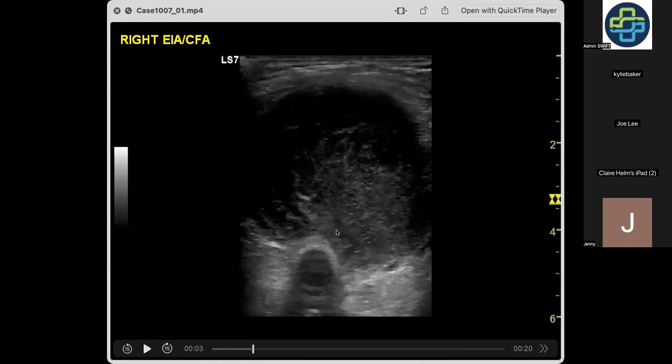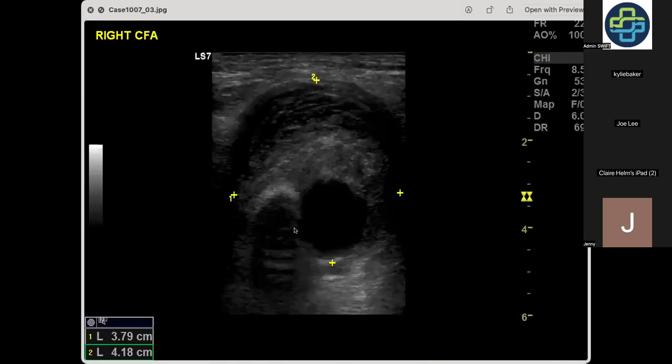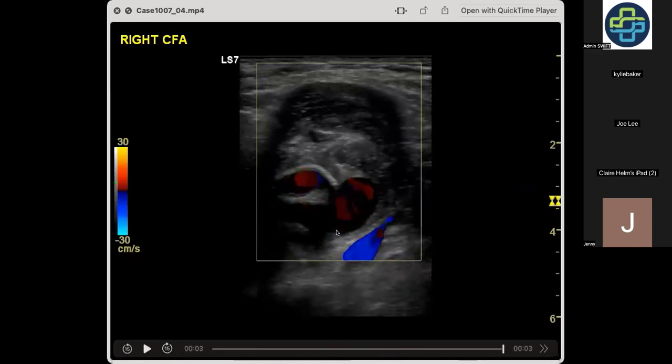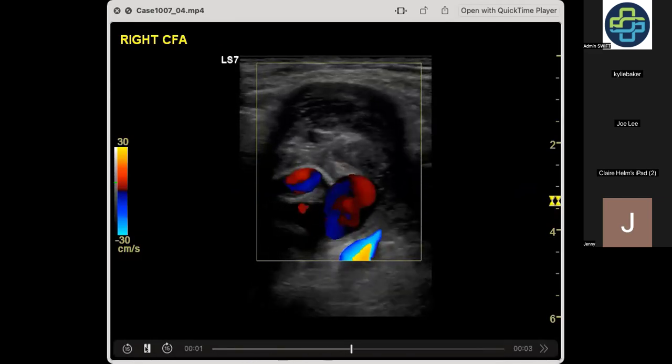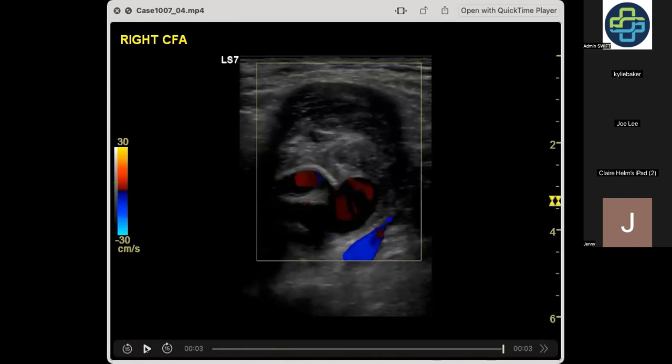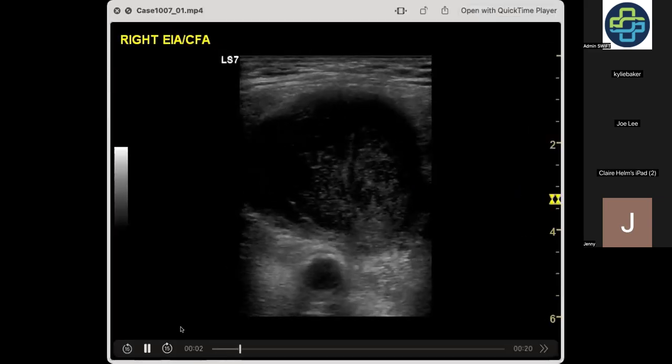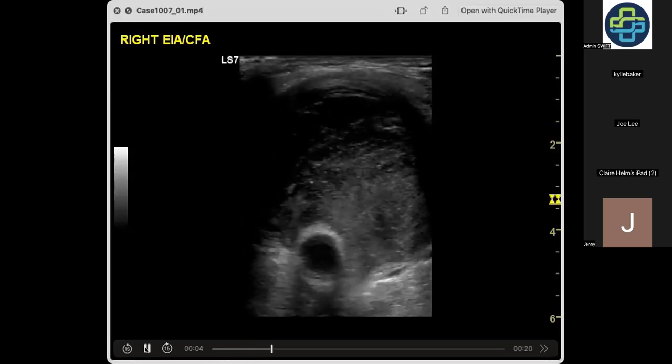Well, let's see if I can. I think we've got some bit of color in there as well. Or is it in a fistula? I can see now. Okay. Well, first of all, let's go back. First of all, I didn't say, but to me that looks like something somebody's put in there. Yeah, it looks like a stent, eh?